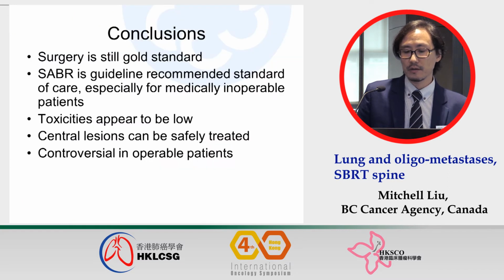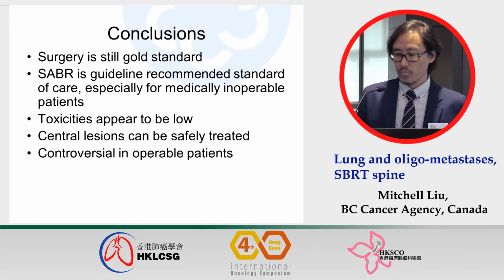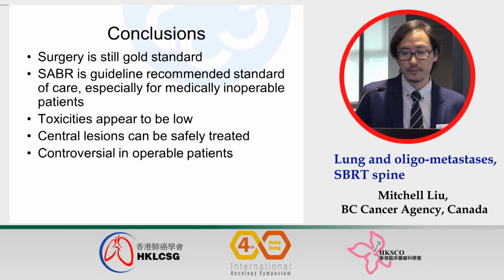So in summary, SBRT is a guideline-recommended standard of care, especially for medically inoperable patients. Toxicity appears to be quite low, and central lesions can be safely treated. Although treating operable patients is quite controversial, and likely surgery is still the gold standard for those cases.